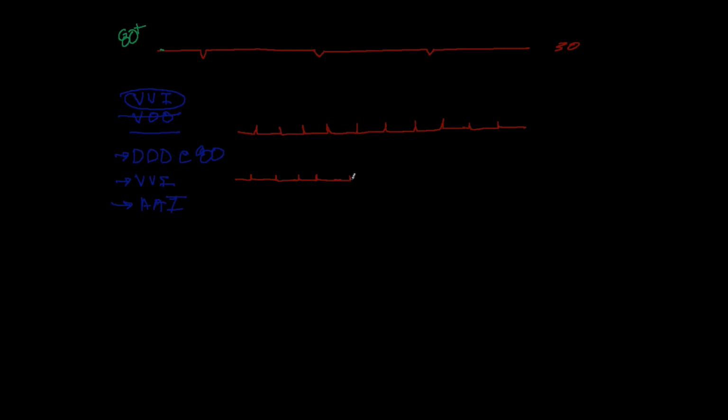And then let's say you back off the pacemaker now that you've got the patient back to a reasonable blood pressure. Things have settled down after a while. You're going at a rate of 60. And then all of a sudden, right when the pacer should be sensing and inhibiting, the native heart actually does go ahead and beat and generate an R wave, but then boom, the pacer paces right on top of that. That shouldn't happen if you're in a VVI mode.